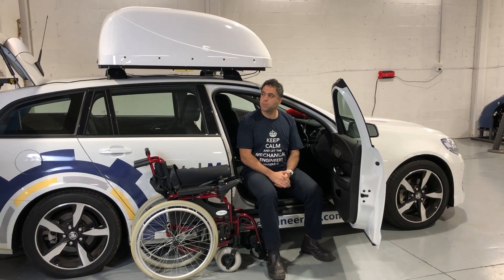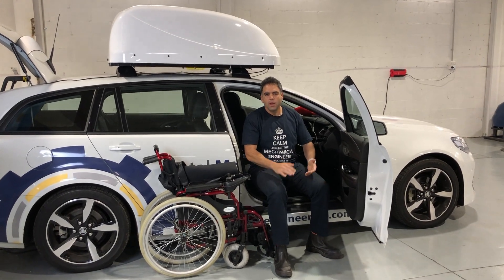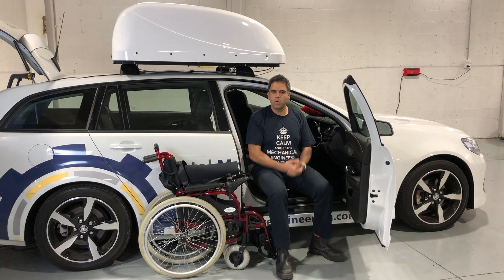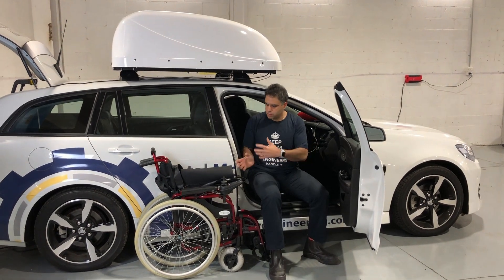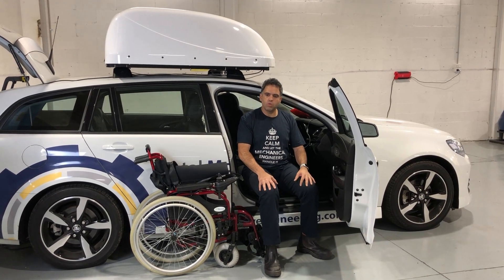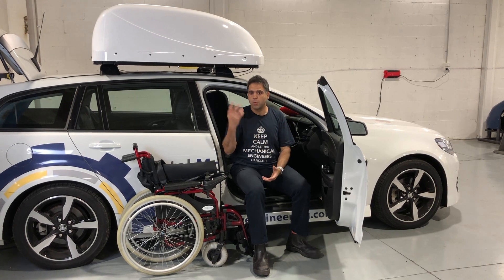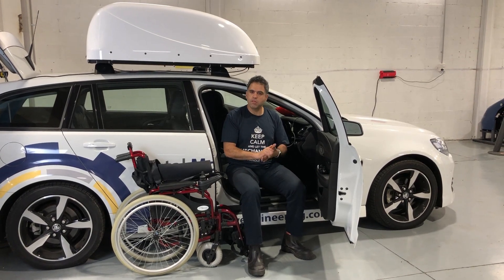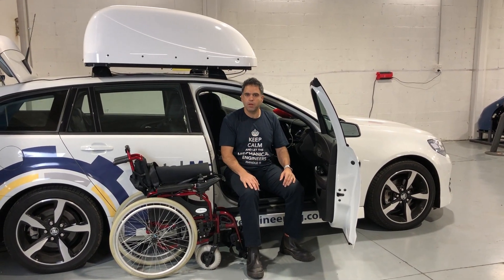So today's question that's come in is around this product — this lovely product up here called the Auto Adapt Chair Topper. The Auto Adapt Chair Topper is a waterproof product that lifts your wheelchair in and basically allows you to transport with your wheelchair, depending on your abilities to transfer in and out. It's a new product that comes out of Sweden — it used to come out of the States but now it's from Auto Adapt in Sweden. It's a beautiful, refined product and I just want to give you a run through on how it works. It's a fantastic product for giving you that little bit of independence.